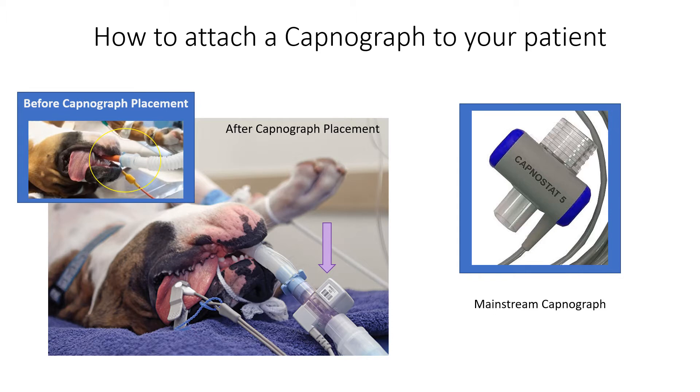The wider end goes over the endotracheal tube, and the narrower end goes into the breathing tubes. The clear part you see in this mainstream capnograph is a wearable item — it's meant to be replaced on a regular basis. If your readings begin to become abnormal or there are cracks in it, it's definitely time to replace it.